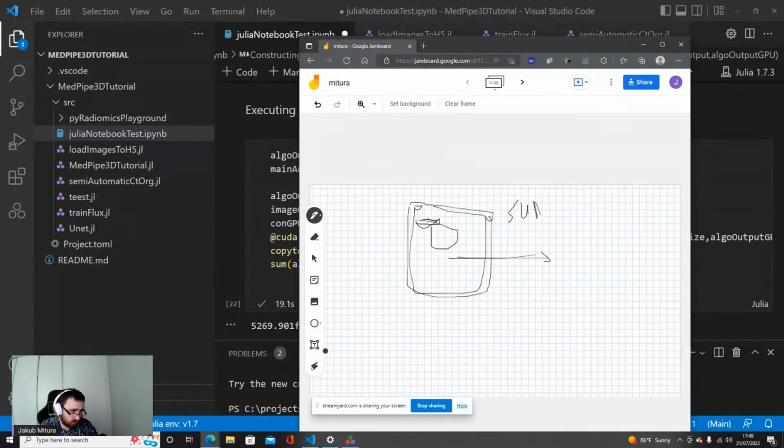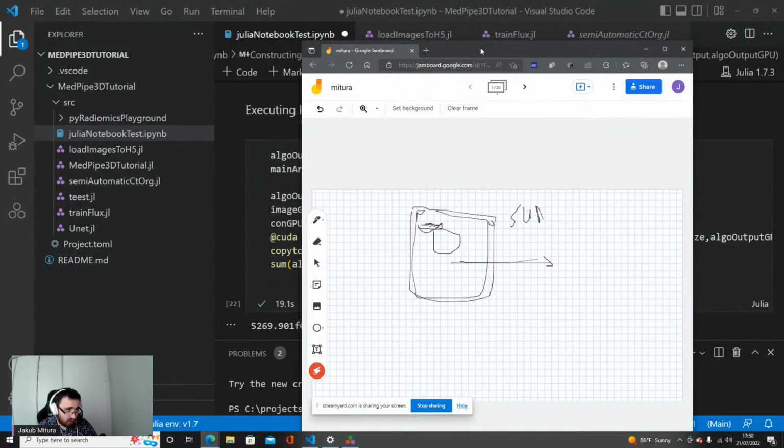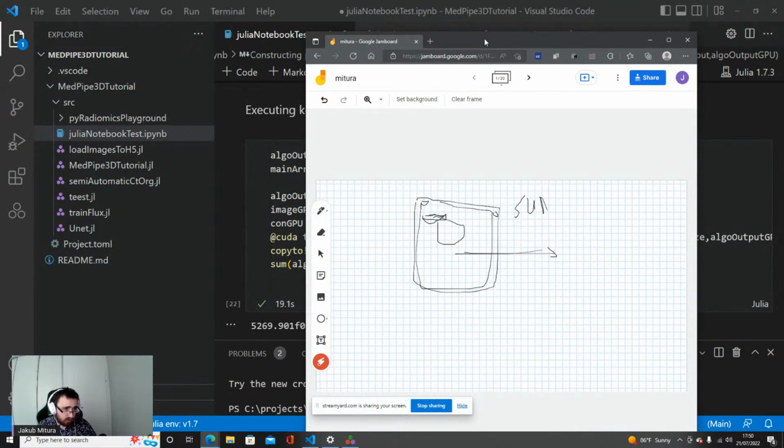Then you do reduction of all warps in the thread block, and then you do reduction of the whole GPU. And if you have multiple GPUs, then between GPUs, so this is in case of the state of the art. In MetricsX it's done like that, so this is MetricsX that I will show you later. It's a multi-stage process here.